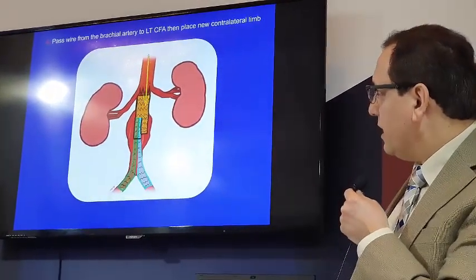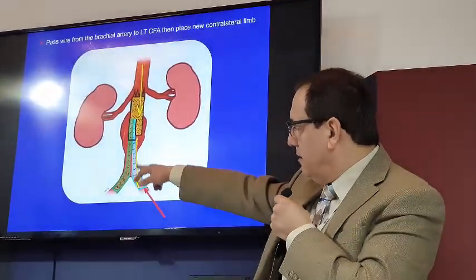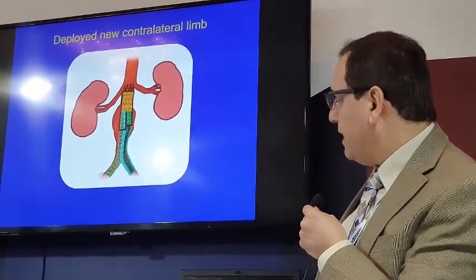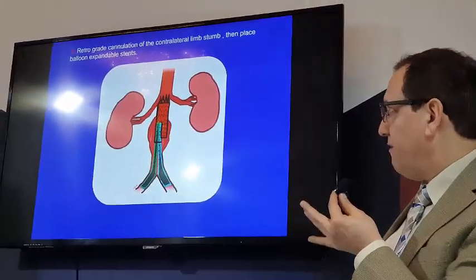Number 4, you can come from above, push the wire to the side of that graft, get a wire from here, snare it, flip it over, and put a new limb. So you can do that. And the last option you can do is the fifth. You have 5 options already.